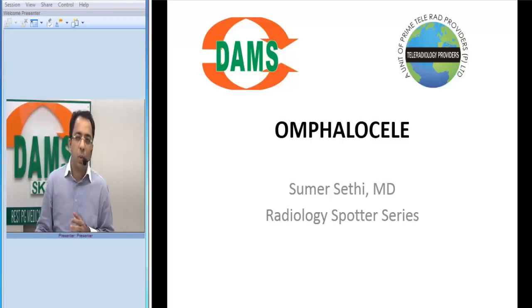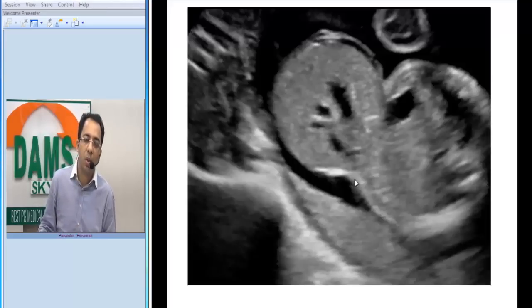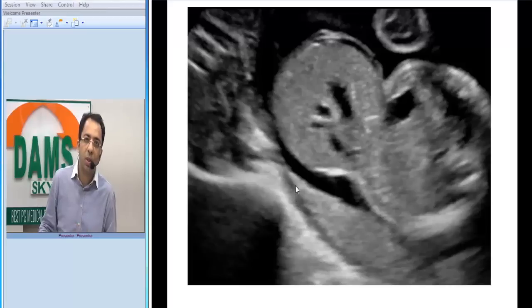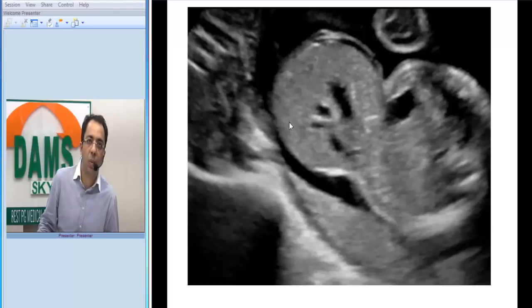To understand how it would come in your exam, this is how an antenatal ultrasound of the fetus looks like. You can see the placenta, the amniotic fluid all around, and the fetal abdomen. From the ventral side, you can see a defect in the anterior abdominal wall through which the liver is seen herniating out.